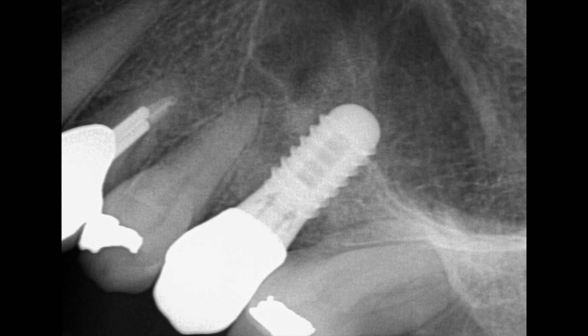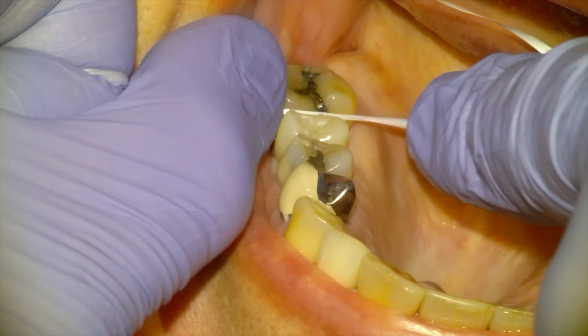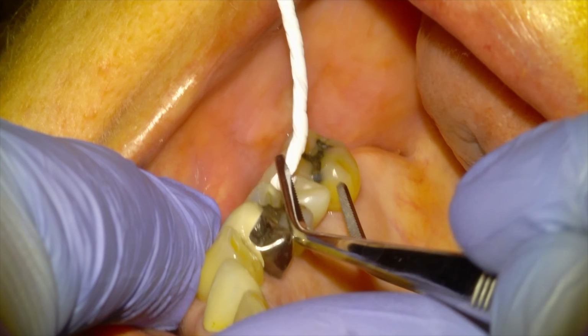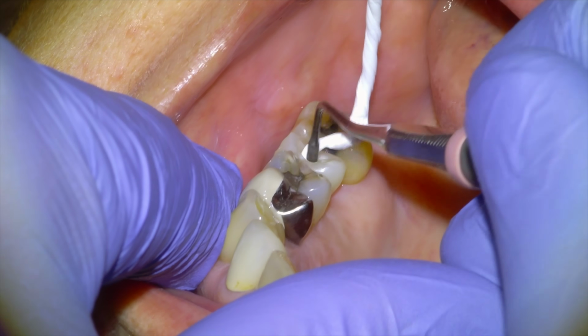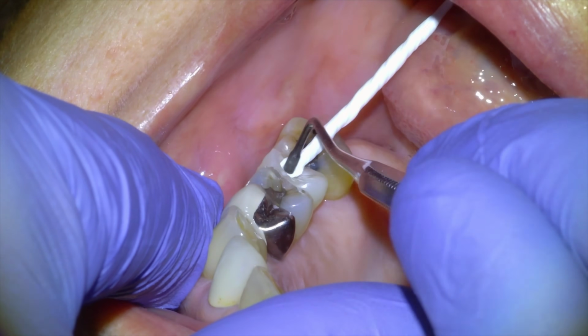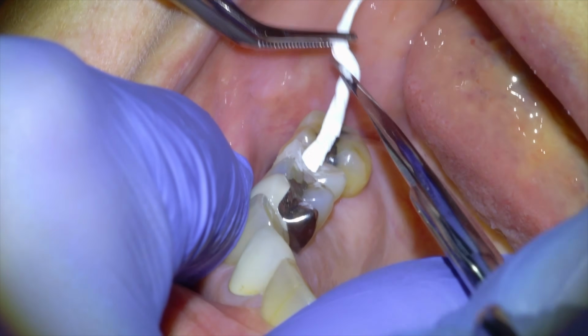There's the x-ray after we had torqued it down to about 15 or 20 Newton centimeters, and everything looks perfectly back to normal. So we'll check the contacts with floss, and we're happy with everything. The bite was good. So we're going to wrap it up and backfill the screw channel access with some Teflon tape and then flowable. And that's pretty much this one.